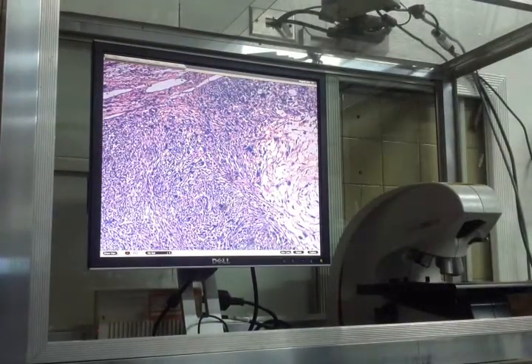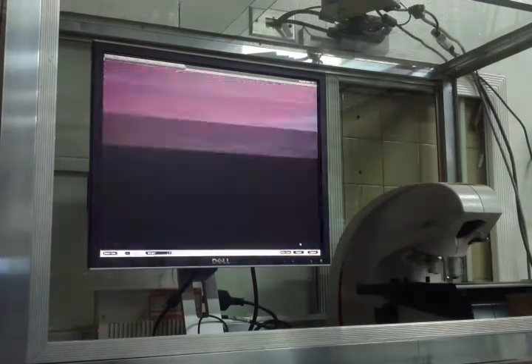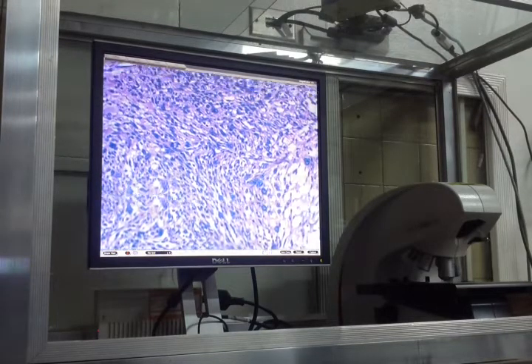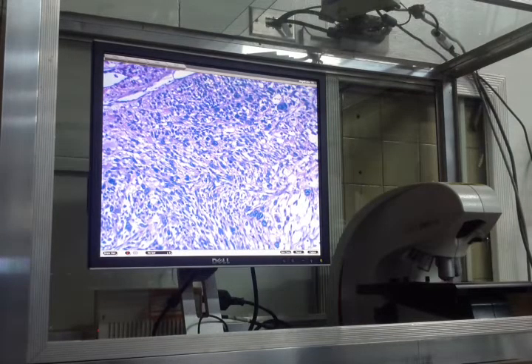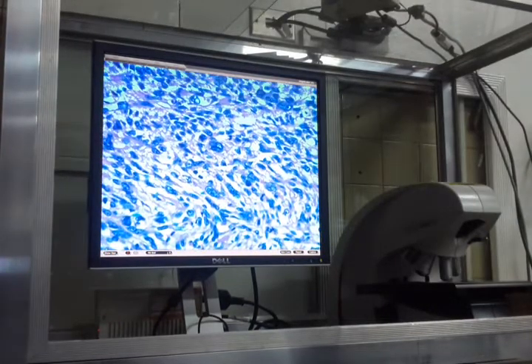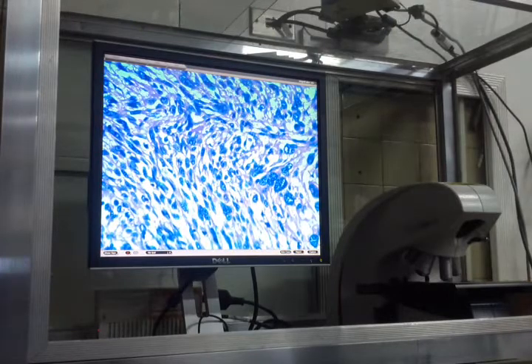Okay. Look at the size of the nuclei. Are they uniform? Meron ba isang big type? Is there nuclear pleomorphism? Yes. Is there nuclear hyperchromaticity? Yes. Do you have very large nuclei, giant cell forms? Yes. Okay? So you have nuclear atypia.